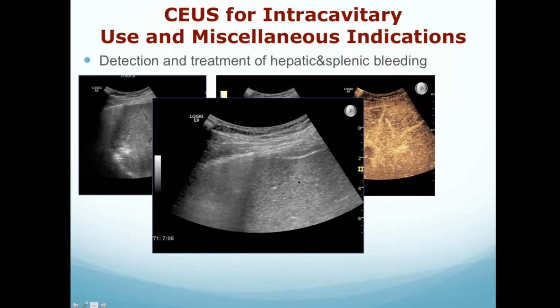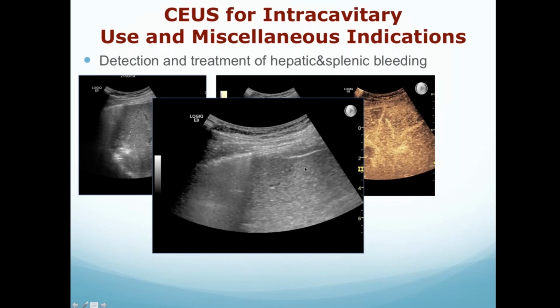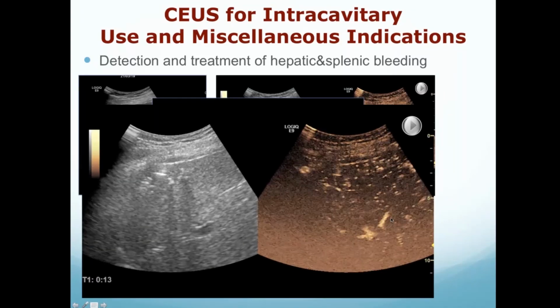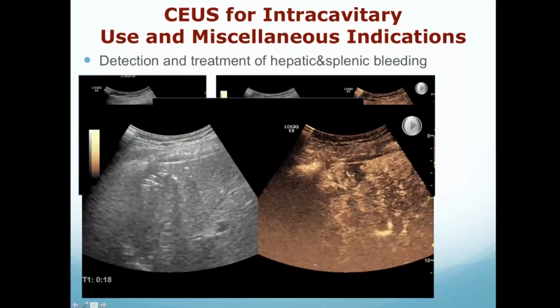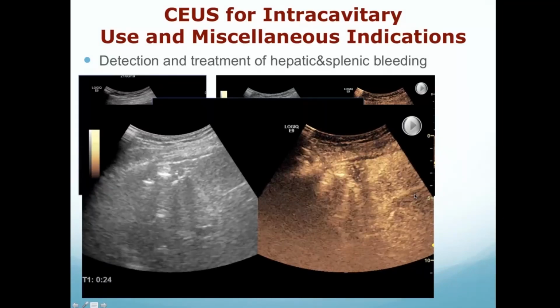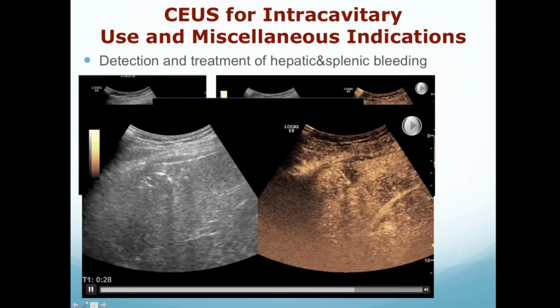and the tract was embolized, and after that we did again a contrast study, and the bleeding was stopped. So we don't see anymore the vessel running out from the liver through the perihepatic area. So the bleeding has stopped and the patient was well. It lasted only 10 minutes to do this.